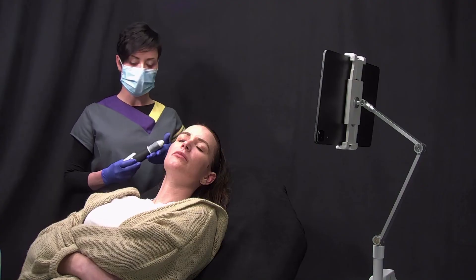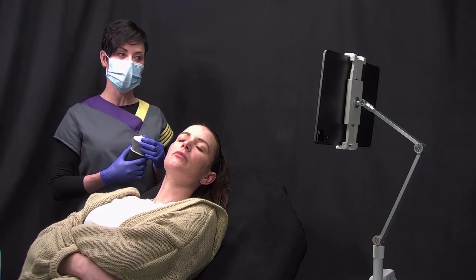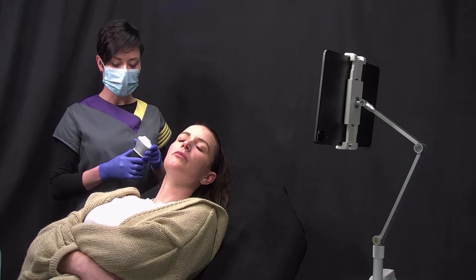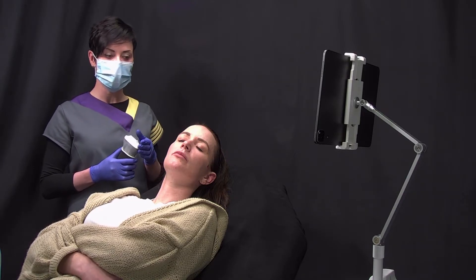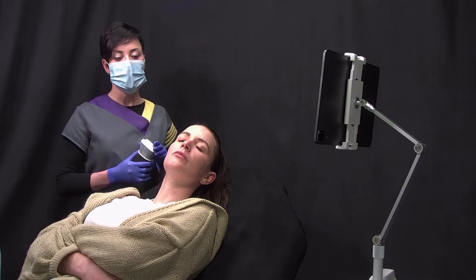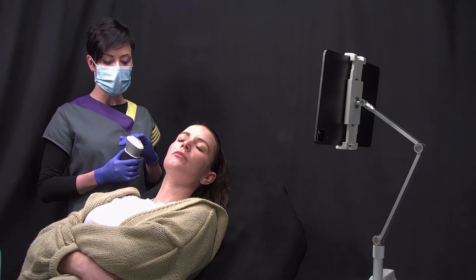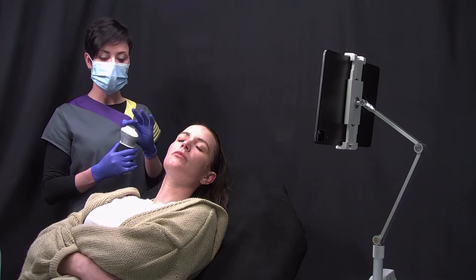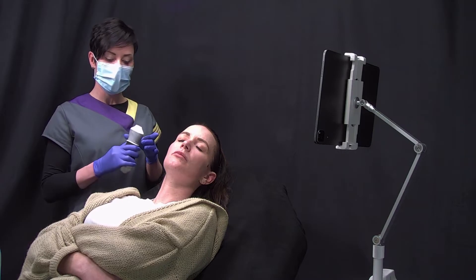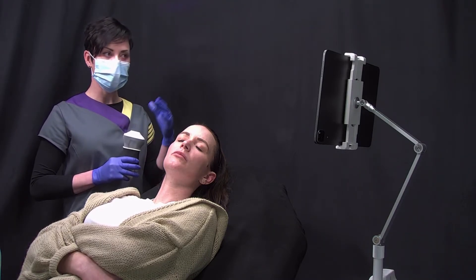I'm going to share my setup for the Clarius. Because we're using ultrasound-guided treatments today, we do need to protect the end of the machine from the surface of the skin. Because the skin has been prepared, we should always place a probe cover over the Clarius. I place a layer of ultrasound gel, then the probe cover, and then I will be using sterile ultrasound gel to maintain contact with the skin. The ultrasound gel beneath the probe ensures that we get a good picture.